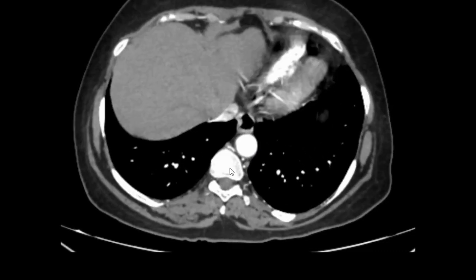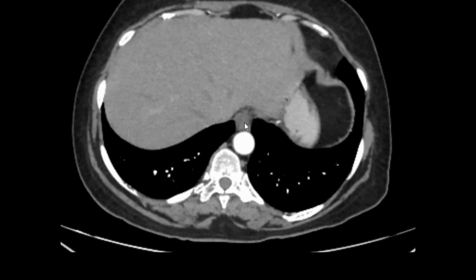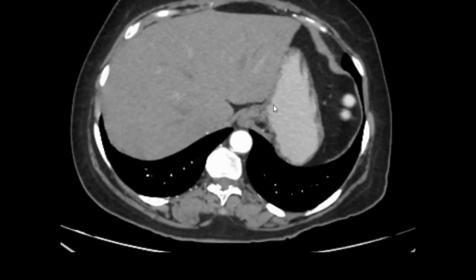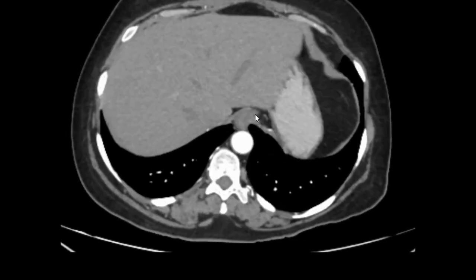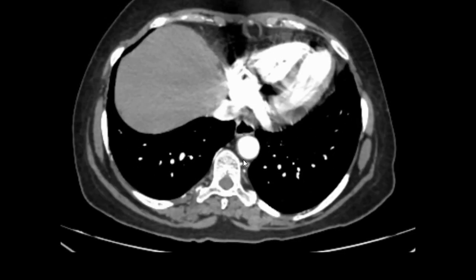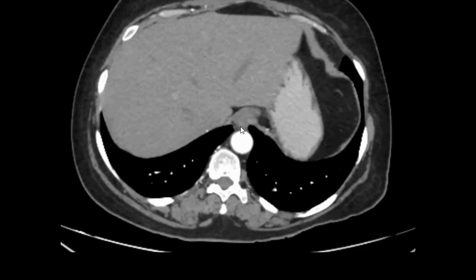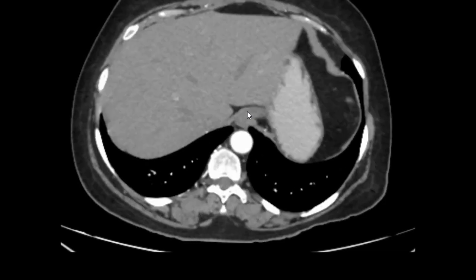When we go towards the abdomen you can easily make out this tubular structure anterior to the aorta. As you keep going, if you follow this structure upwards you can see it forming a tube, and keeping the cursor there it is between the heart and the aorta. This structure is the esophagus.